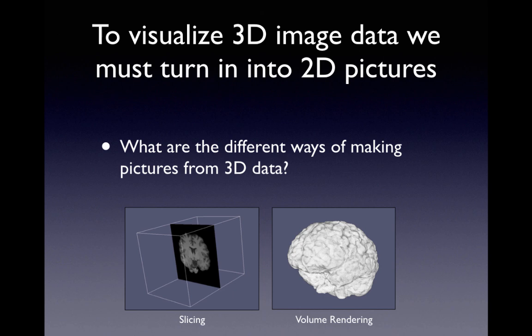There are also different kinds of volumetric techniques. An example here is volume rendering, where you look at some kind of surface representation of the data, or something different.